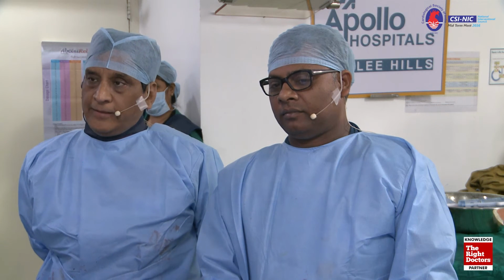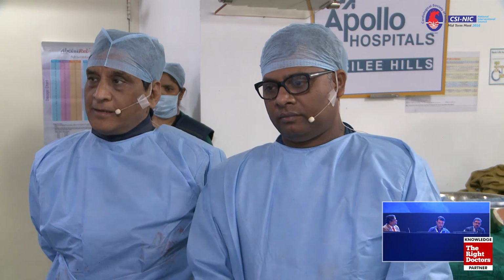But I think what we learned in the early stages is that it's not simpler than the technique which I showed today. They still require many times 2 stents, maybe a 3 stent approach. So bifurcation stenting has really not gone further, unlike the absorbable stent, where the field has moved quite far, but bifurcation has remained the same. Even if the Triton stent gets approval, it's bare metal more for the side branch than the main vessel. So while bifurcation stents look very exciting, I don't see any clear winner in the next few years over our 2 stent techniques.